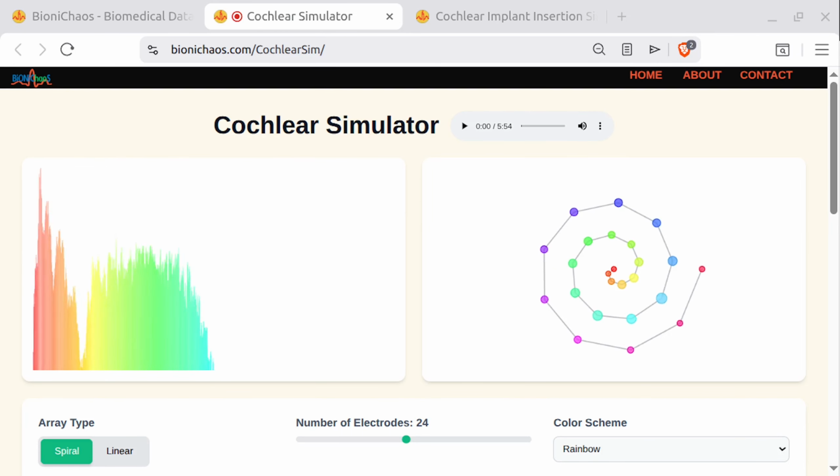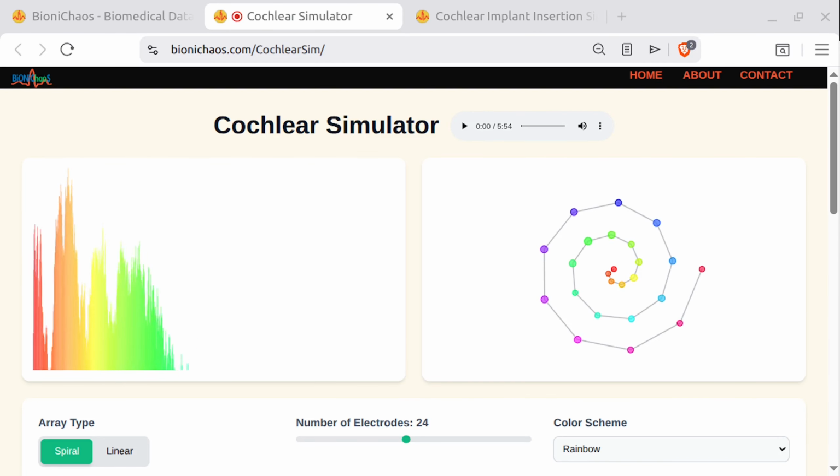But even when the device works perfectly, the daily practical burden is relentless. Just think about the battery. It's a rechargeable system. To a clinician or an engineer, a battery is just a lithium-ion power source. To a patient, a dead battery is a sudden, jarring plunge into total isolation.